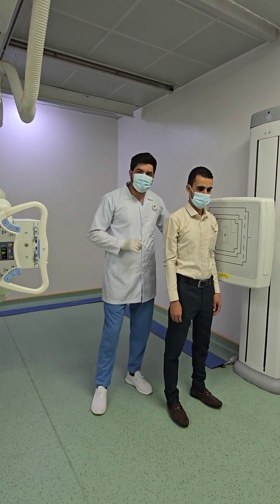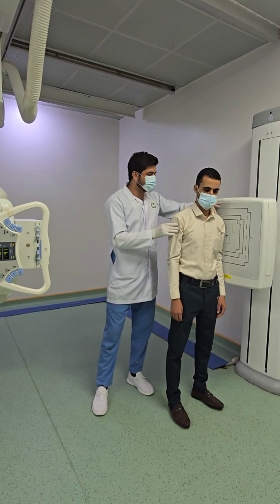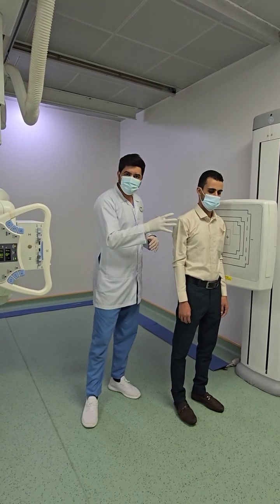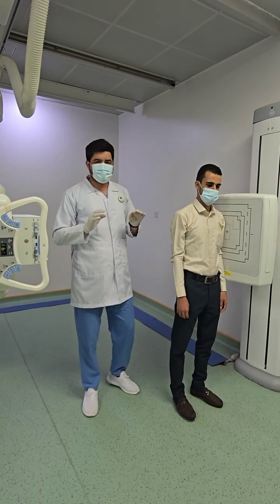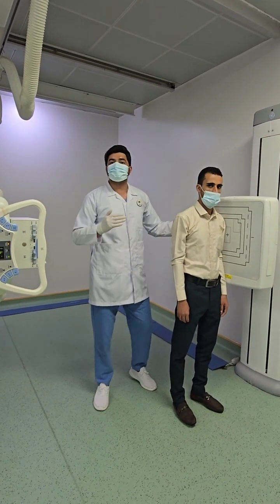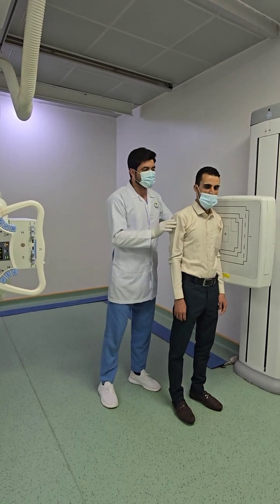Now here, the left side of the patient is near to the detector or attached to the detector, and the body is in the lateral view because the X-ray is entering at one side of the body and emerging out of the other side of the body. But which side of the body is near to the detector? The left side. So this is left lateral. Okay, left lateral finished. Now come to the right lateral.